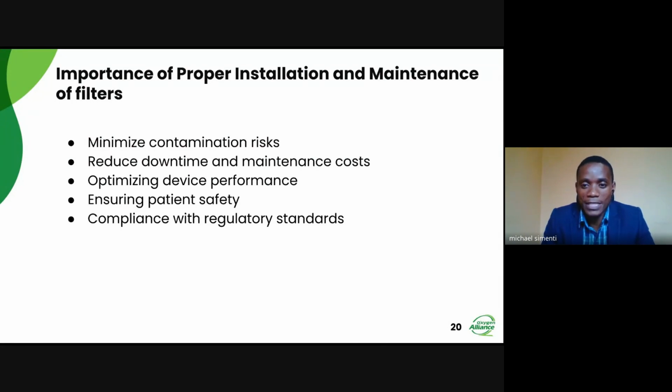If we take those steps, we have cleaned and removed any particle that could compromise the lifespan of the device, or compromise the oxygen if it gets delivered to the patient. In that way, we are mitigating any risk that may arise to the patient's life. And at the same time, if we are properly installing these filters, we also reduce the downtime and maintenance costs of these devices. Let me give you an example.